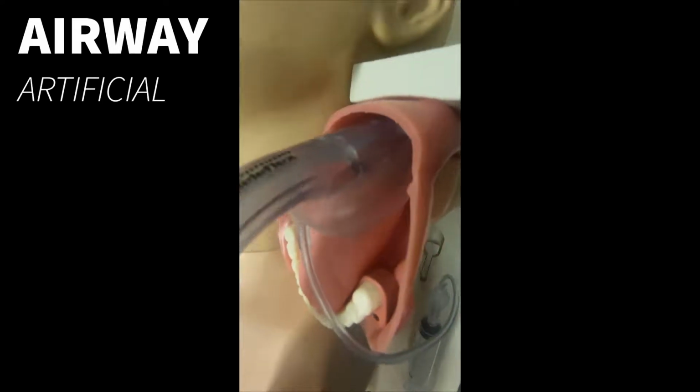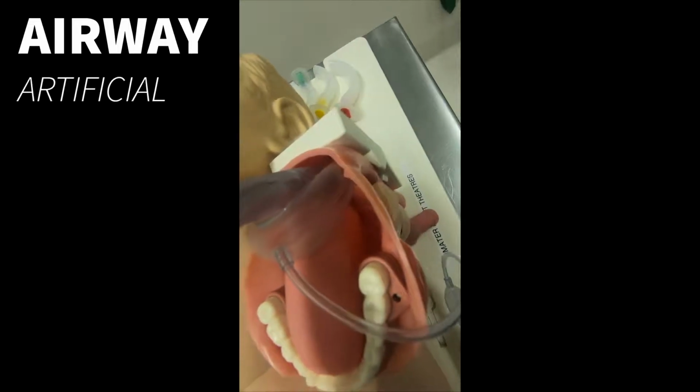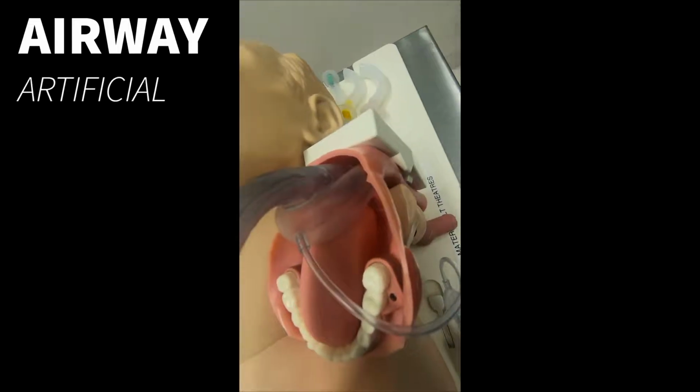Okay, so what we have here is a masking of the airway. If I open this up, you can kind of just see the epiglottis there. The tip is in the esophagus, and I'm forming a mask over the larynx or the voice box.